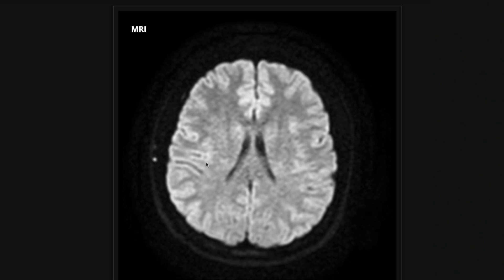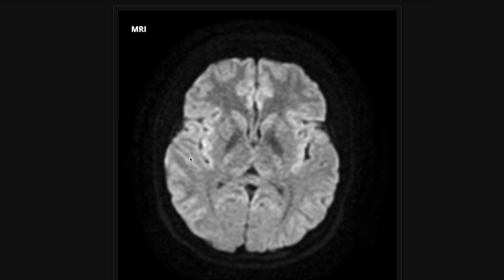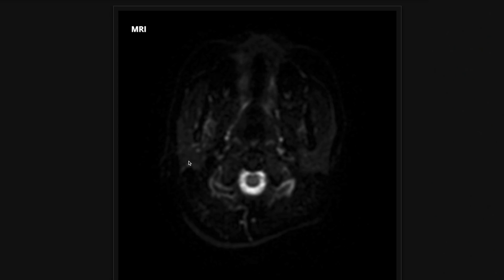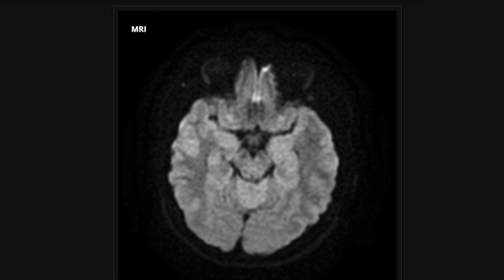Beyond strokes, there are other things that show up bright on diffusion-weighted imaging. Very cellular things also demonstrate diffusion restriction — so a very cellular tumor like glioblastoma will show up bright on DWI. Similarly, an abscess will also have diffusion restriction. So it's not just strokes, but strokes is the big one and what we're looking for most of the time. The diffusion is good for ruling out stroke — it's the most sensitive sequence. The FLAIR will also eventually show a stroke, but early on diffusion-weighted imaging is going to be your best bet.